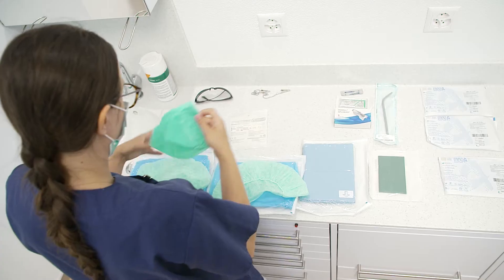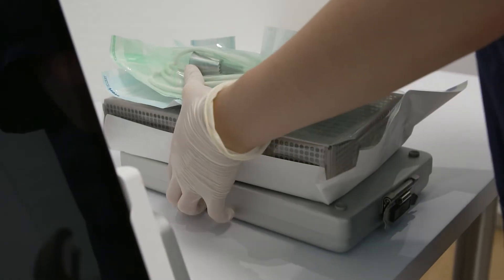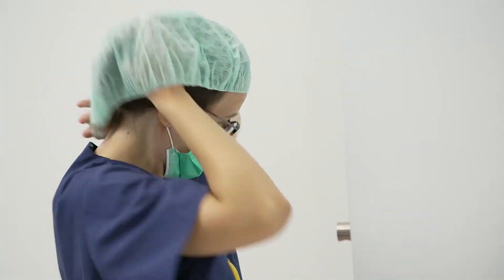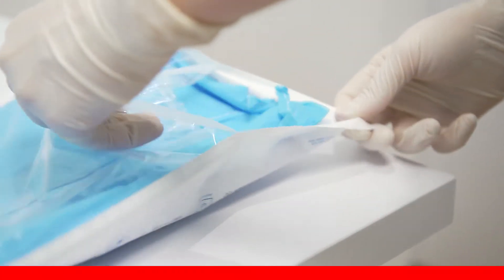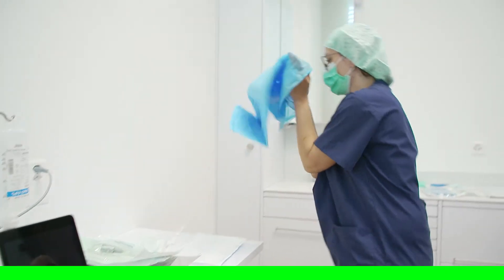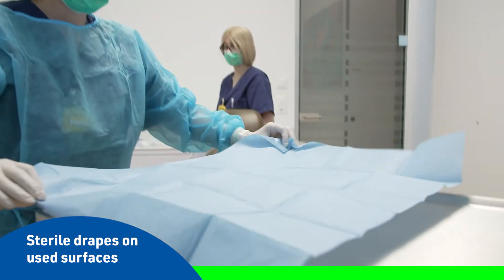The surgical team will follow the sterile contact rule within the sterile zone — persons who are sterile touch only sterile items. For this purpose, the surgeon and assistant are supported by a second non-sterile assistant. Activities performed by the first sterile assistant are highlighted with a green bar; activities by the second non-sterile assistant are highlighted with a red bar.